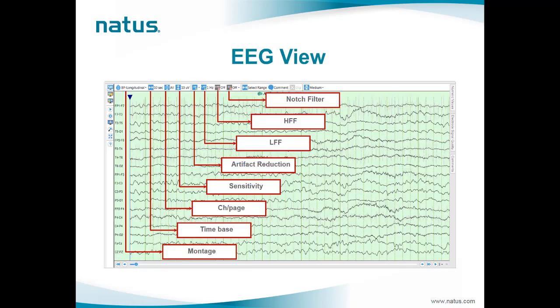The EEG view displays the EEG montage with the opportunity to change it and modify visualization parameters like filters, sensitivity, and time base, as commonly used in any EEG program. Users also have the opportunity to enable the artifact reduction option, which detects and reduces artifacts caused by EMG, electrodes, and high movement, resulting in a much cleaner EEG. The original signal is always shown in the background in a gray color, allowing you to see what has been changed.